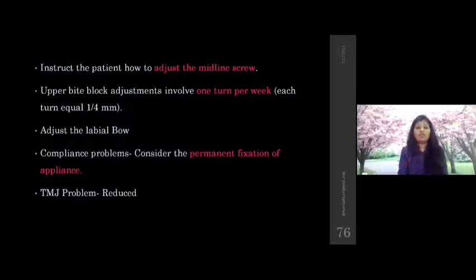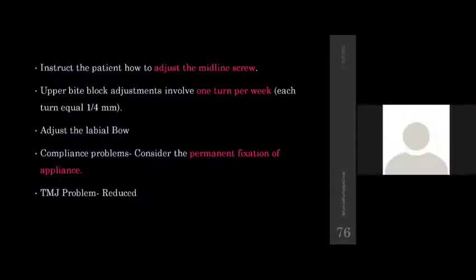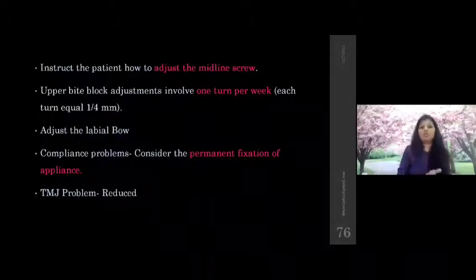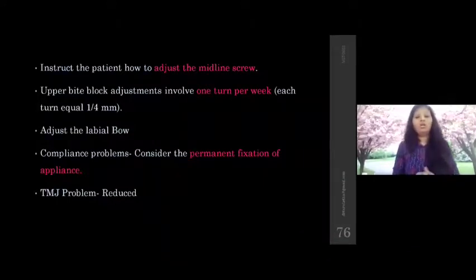How do I do the permanent fixation? On the lower appliance, you apply zinc phosphate or else your GIC and then fix it on the teeth for 10 to 14 days. It is for only 10 to 14 days. Once you achieve a good amount of compliance from him, then you can remove it and use it as a removable appliance. If after that also the patient is not at all cooperative, then you can go ahead and give your fixation both in upper and lower for around 1 to 2 months.